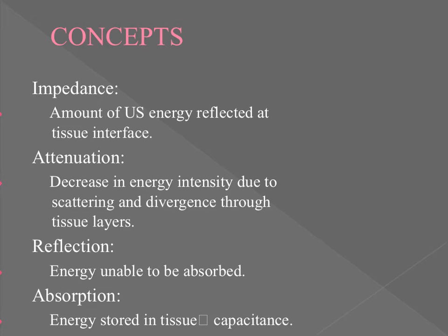Okay, so there are some concepts that we probably need to talk about before we really move forward to actually talking about the clinical utility of ultrasound. We have the concepts of impedance, attenuation, reflection, and absorption, right? And most of these are terms that hopefully all of you have heard at some point in time or another. But this idea of impedance represents the amount of ultrasound energy that's reflected at the tissue interface, right? So let me say that again. The amount of ultrasound energy that is not going to get delivered to the target tissue.